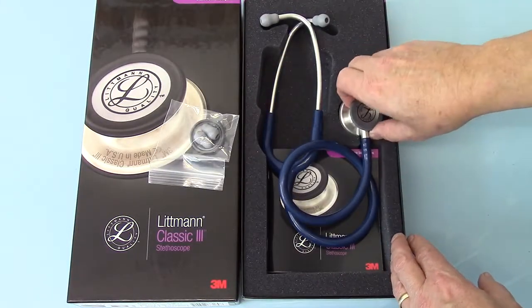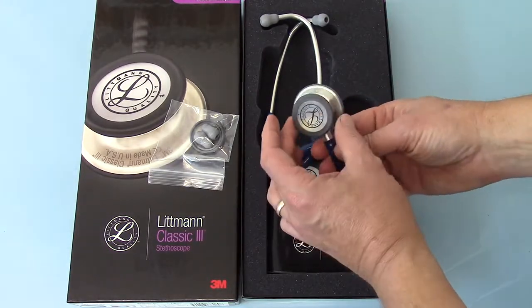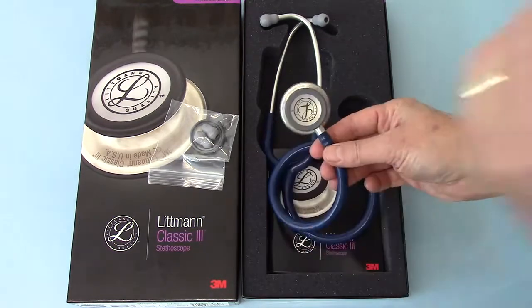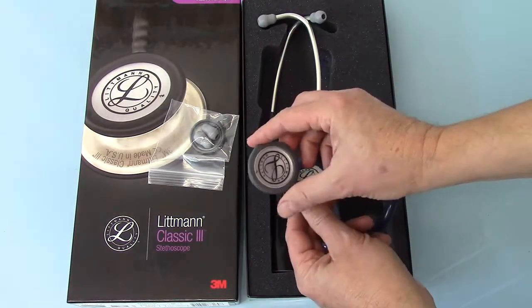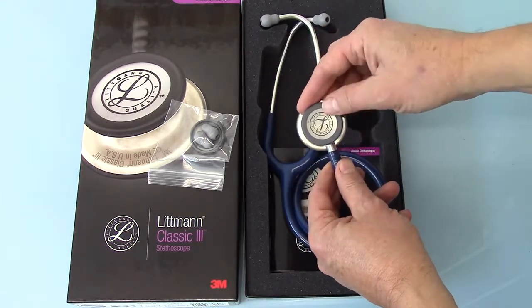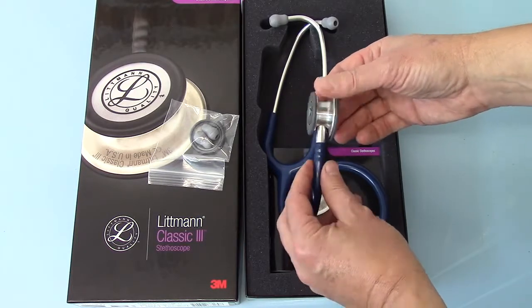The reason for the ring in the pack is so that you can convert the smaller end chest piece to a standard bell configuration. When you buy these out of the box you'll see that you get a double diaphragm configuration, both on the standard adult size and also on the smaller or paediatric side. This is a newly designed chest piece.